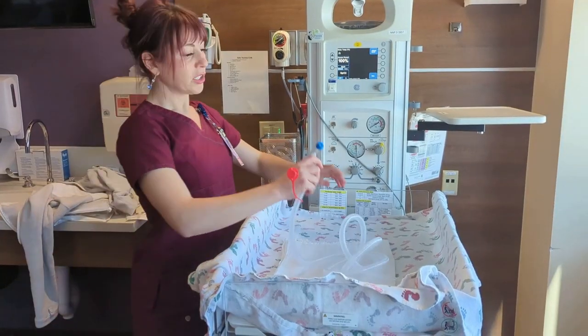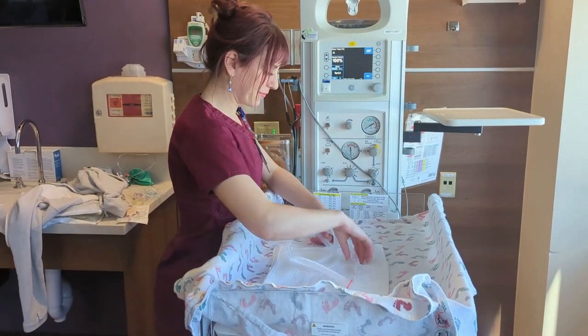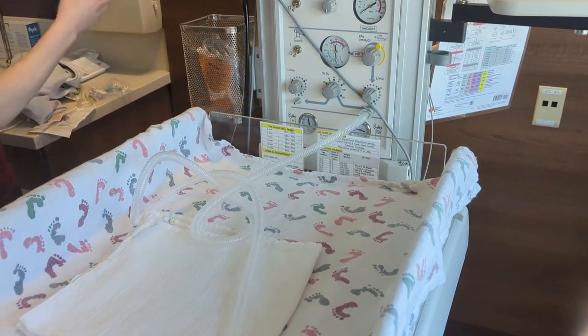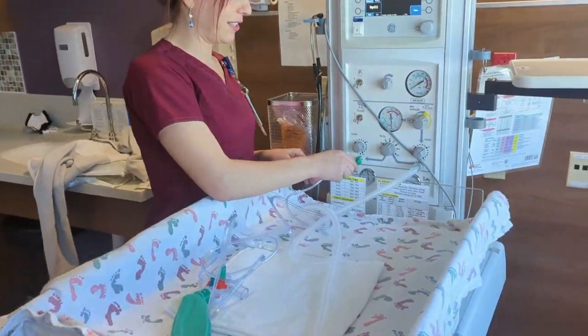Next, we should test out our respiratory device. If you have a T-piece, go ahead and plug it in here. If you are using a flow inflating bag, you can plug that in over here.